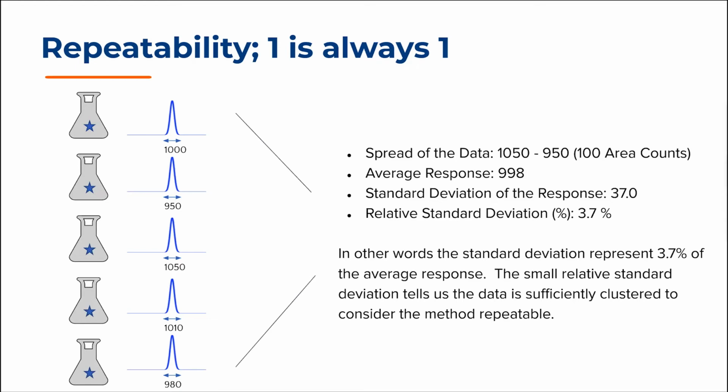It is worth noting, repeatability is a measure of the variability in the measurement taken on a single instrument or by a single person under the same condition. Reproducibility measures whether the entire analysis can be reproduced in its entirety. Reproducibility can also be referred to as intermediate precision and will be discussed next.